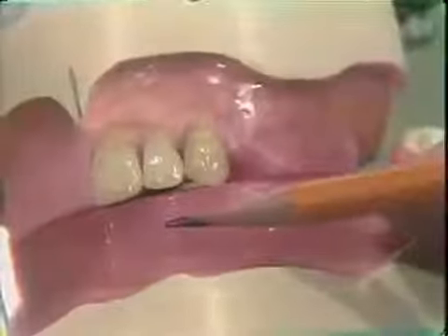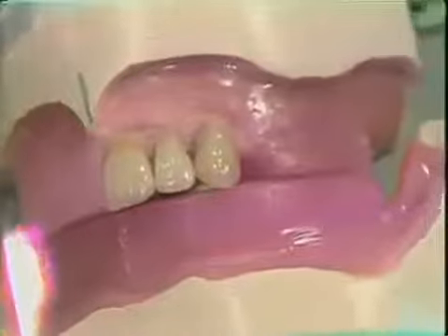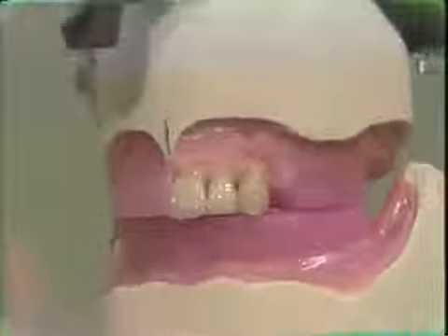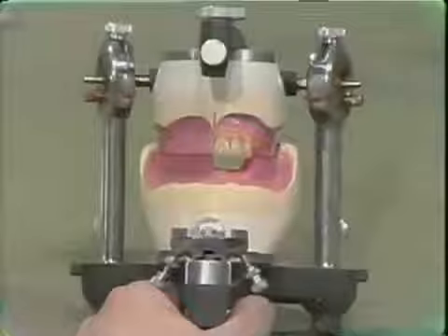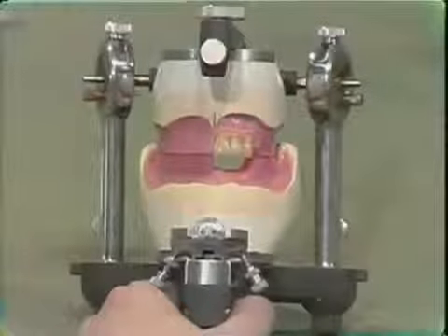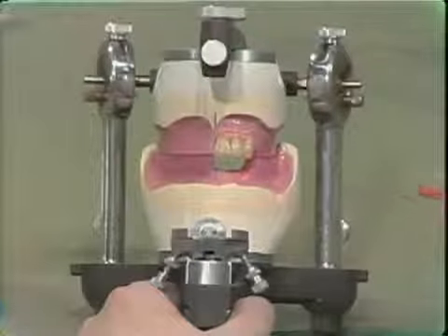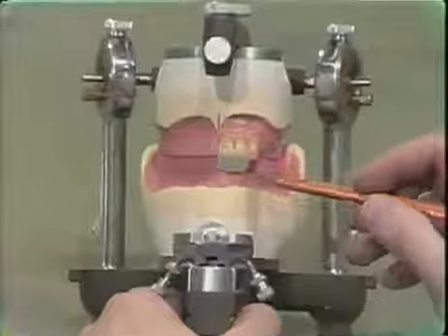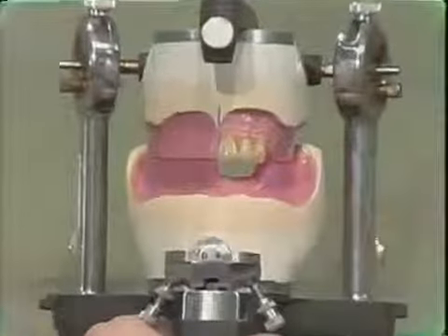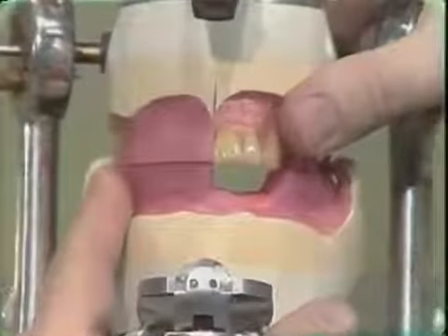After properly arranging the maxillary anterior teeth to one side of the midline, we are now ready to set the mandibular anterior teeth. The mandibular wax occlusal bite rim has been reduced from the midline to the first bicuspid area in order to accommodate the anterior teeth. This wax removal permits proper alignment and positioning of the anterior teeth. The posterior wax bite rim is left intact to maintain the proper occlusal vertical dimension.